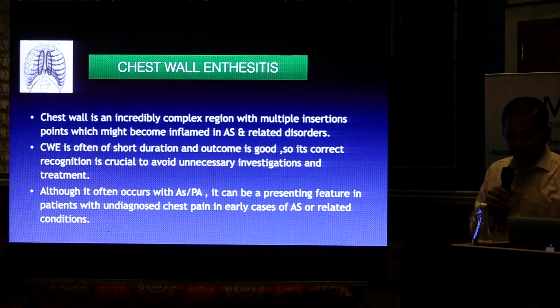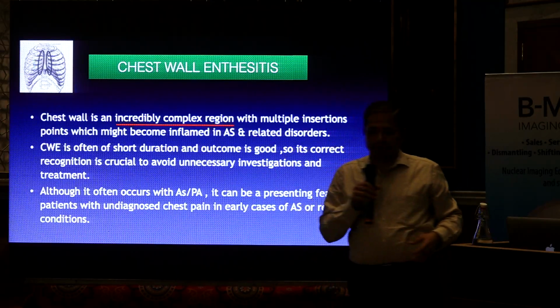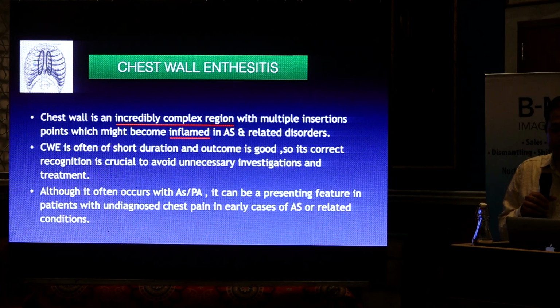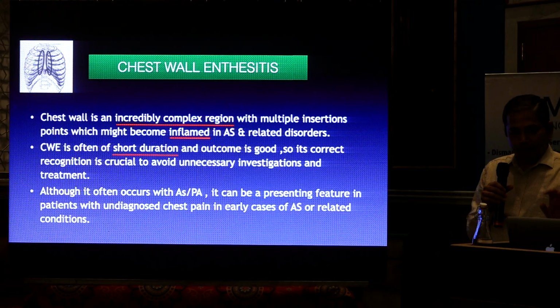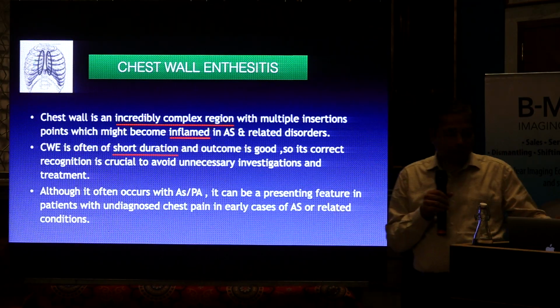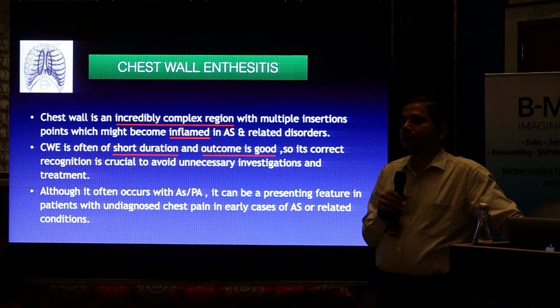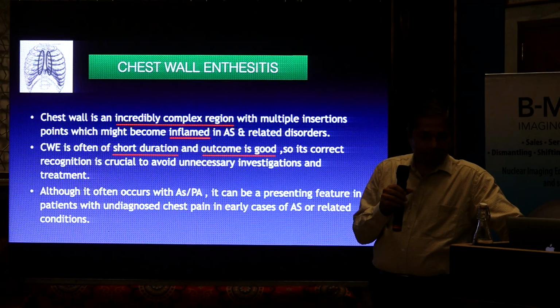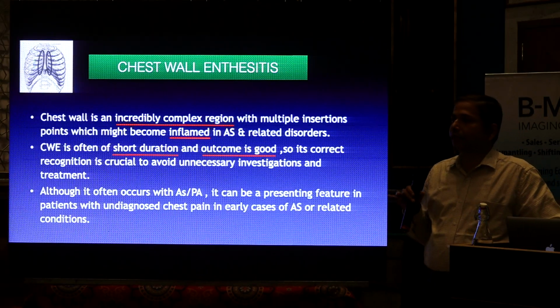Actually, if you see the chest wall, it's an incredibly complex region. You will see there are multiple insertions in there, which get inflamed in ankylosing spondylitis. The best thing is that these chest wall enthesitis cases are of short duration and the outcome is very good if they are correctly diagnosed. Second thing is that you need not do any other investigation to prove it.